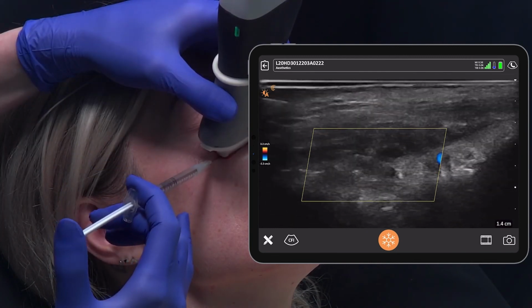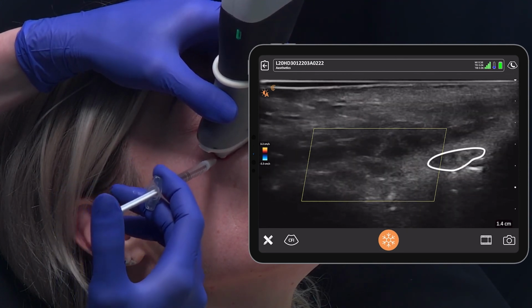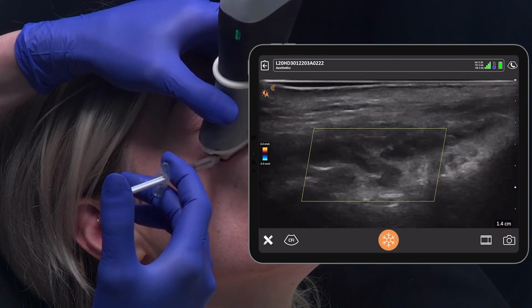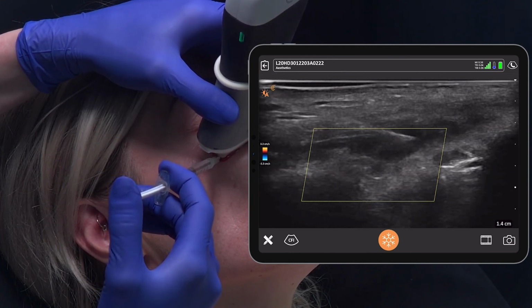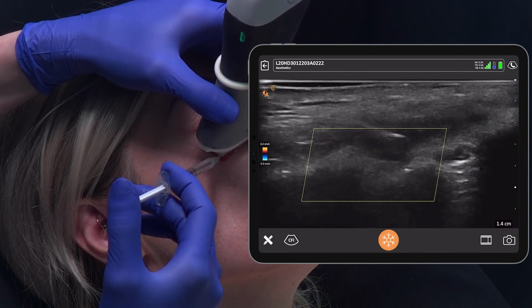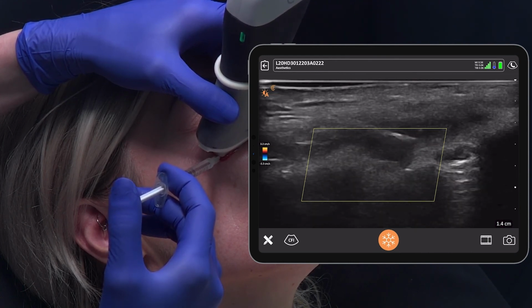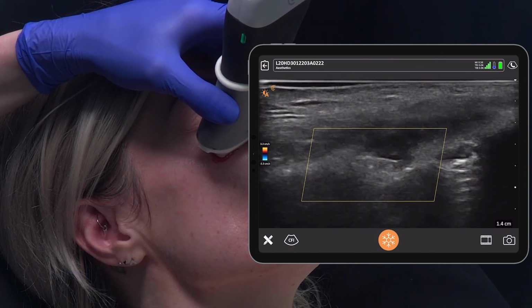I'm going to treat this deposit again with another dose. The filler treated just now has taken on this cotton wool-like appearance. This is very typical of filler after hyaluronidase and is due to the change in rheology affecting sound wave reflection. It's taken 2 tiny doses, no more than between 30 to 45 units per deposit. I work with a 5 ml dilution on 1500 units, so this is 30 units for 0.1 ml. I found this is the ideal concentration for aesthetic correction.